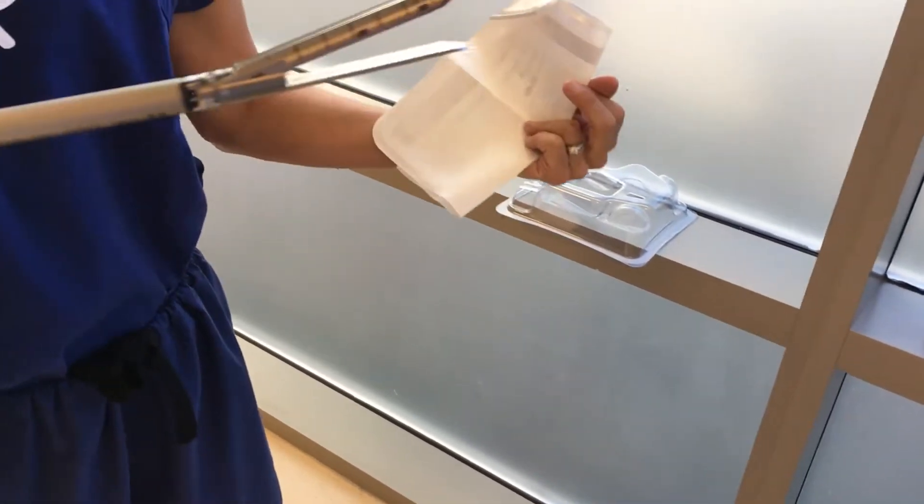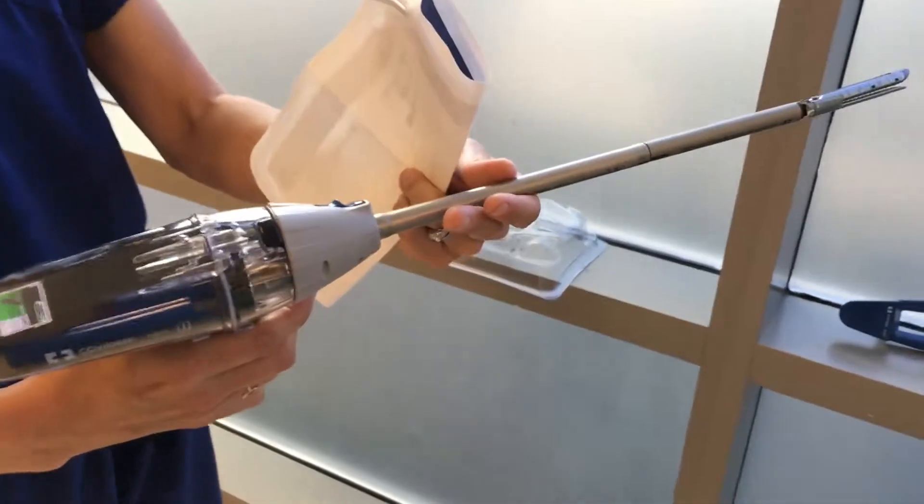Then you pull it out of the trocar, either closed or open. Preferably closed so that it doesn't pull the trocar out.